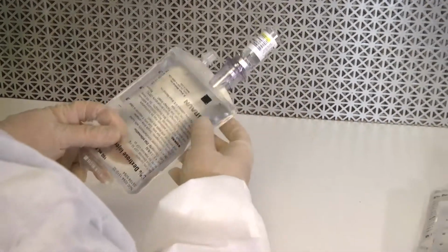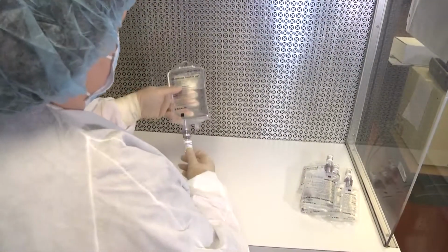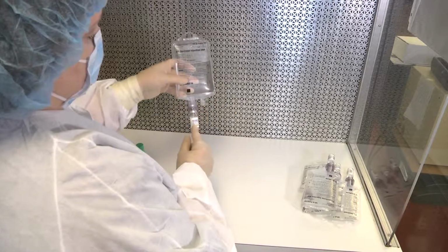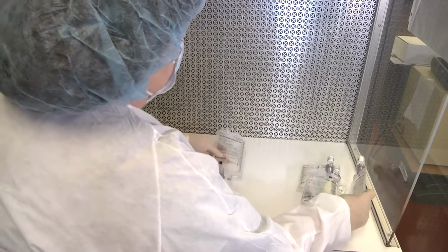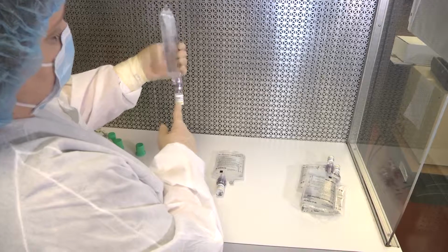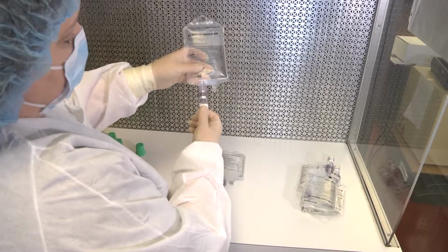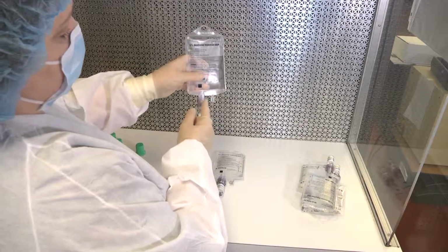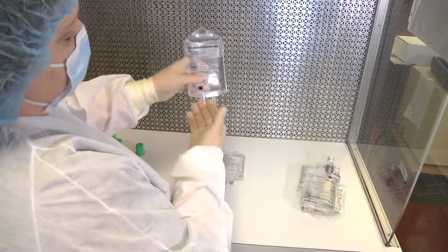Now, once they're attached, the very important thing is to leave them in that position. For instance, a lot of people like to show the writing on the IV bag and the writing on the vial to look like this, and that is great. But if you have one like this and the writing is to the side, you have to leave it, because if you twist it like this, every time you twist that vial, it puts pressure on the opening of the vial and the rubber stopper, and that's what would make IVs leak.